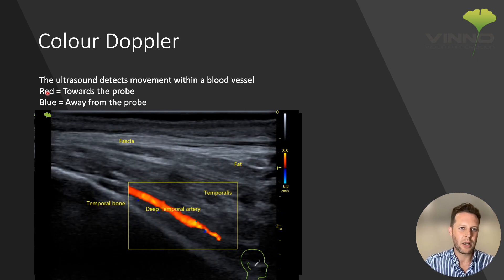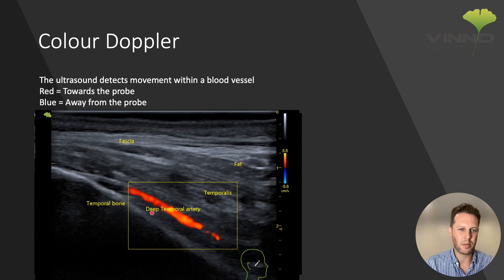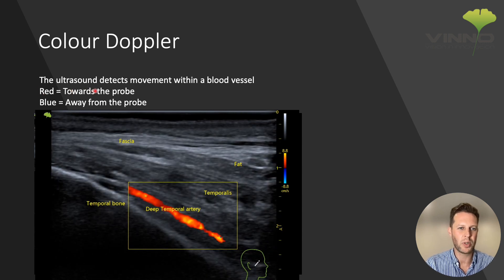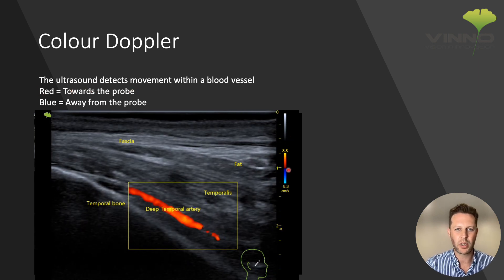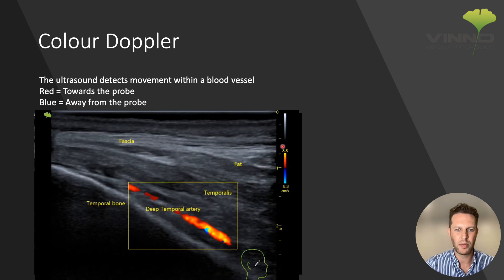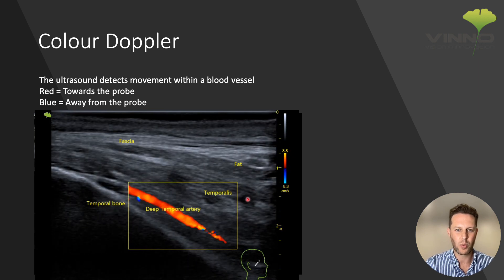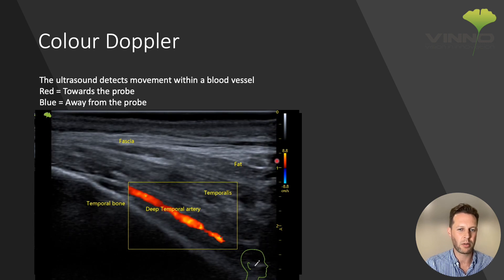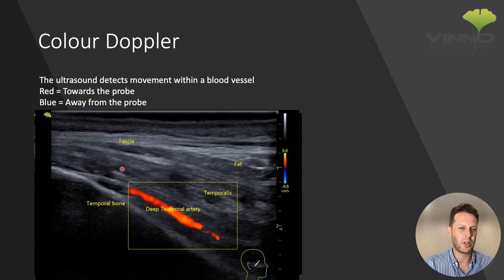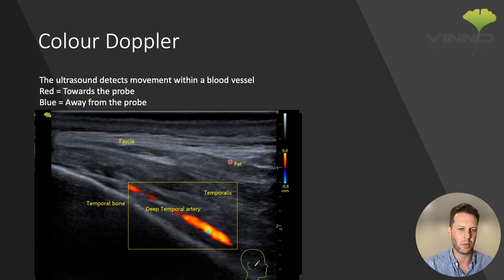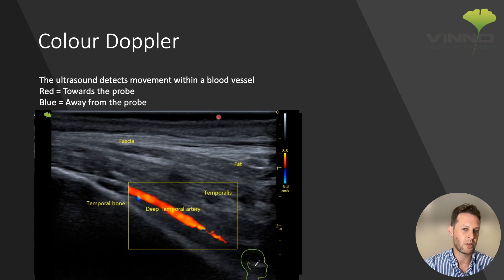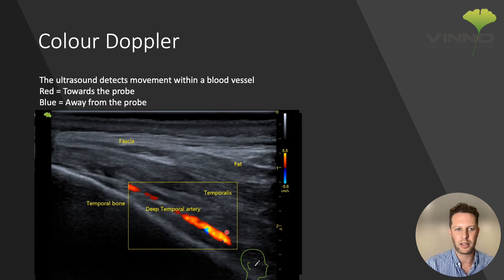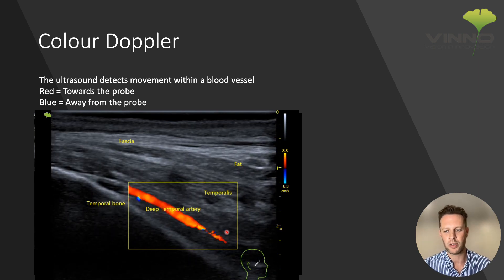One thing to mention is that the colour indicated by the ultrasound machine — red — is movement towards the probe. Anything moving from deep to superficial is going to appear red, and anything moving the opposite direction, from superficial to deep, is going to appear blue. It doesn't indicate or differentiate artery from vein.